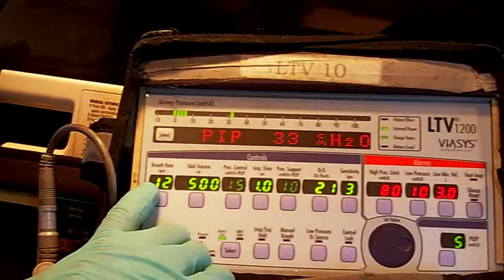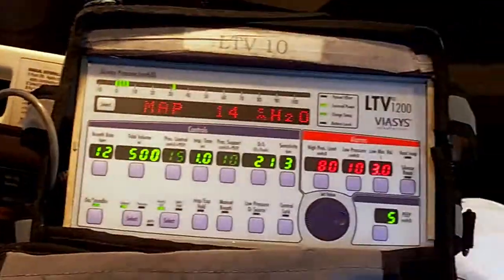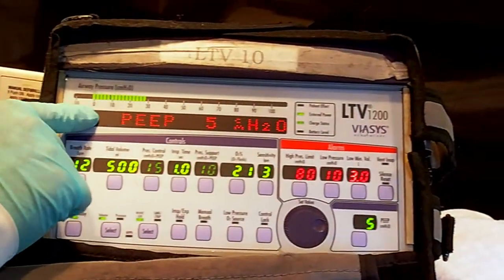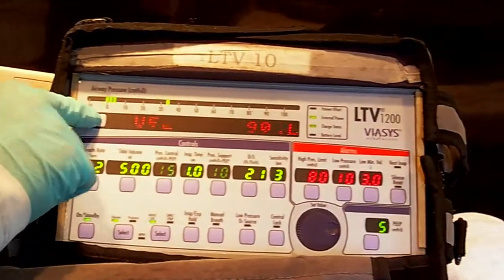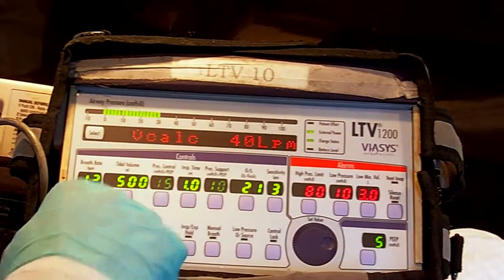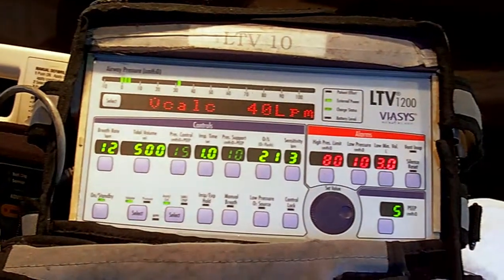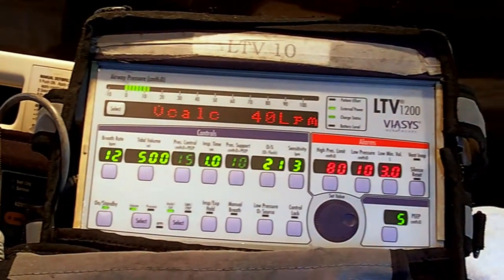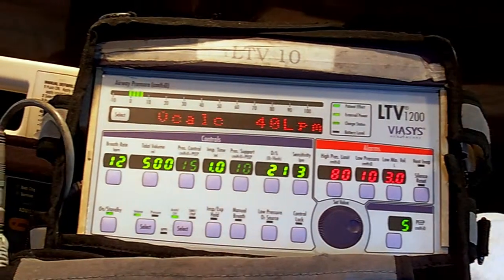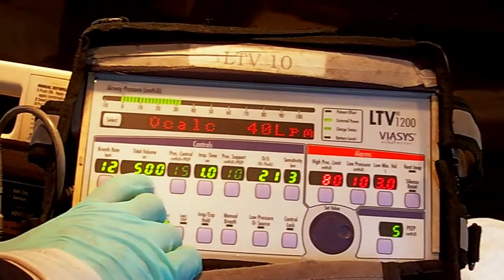The trigger will be elapsed time. The target will be flow — you can see here flow is 40 liters per minute at this setting. So 40 liters per minute will determine our target. And the cycle, what tells the ventilator to stop the flow and go into exhalation, would be the tidal volume — 500 ml.